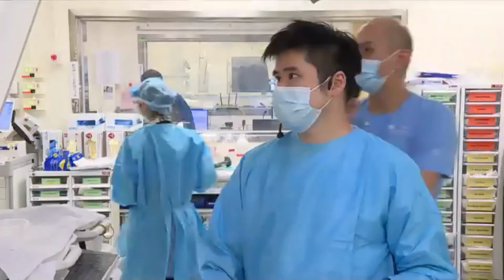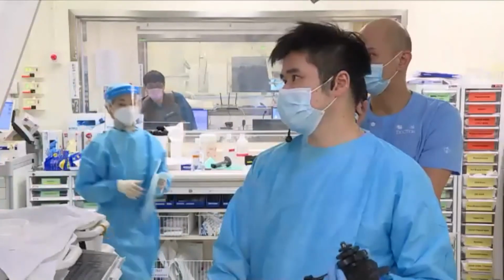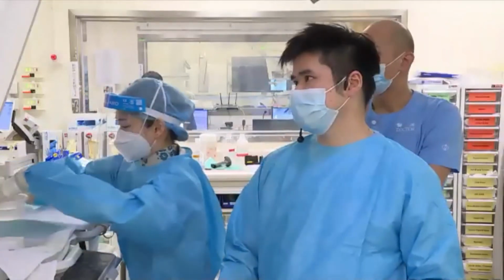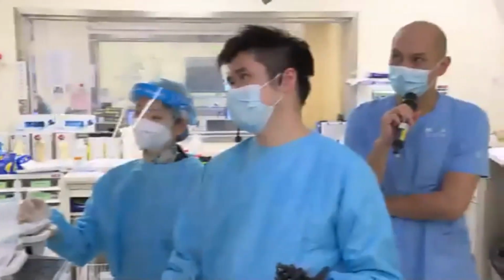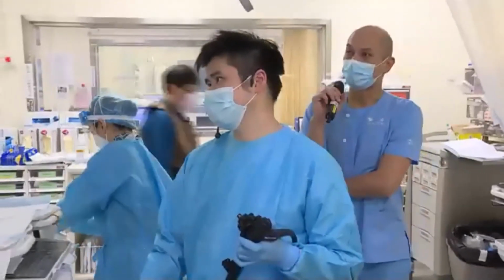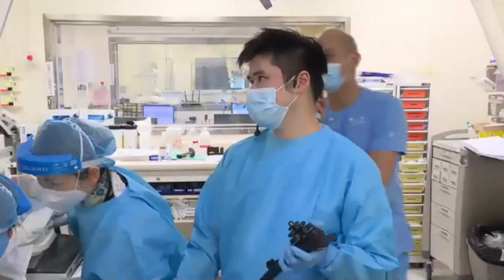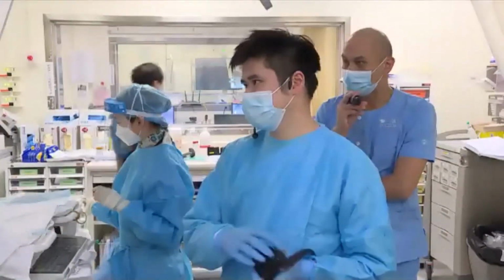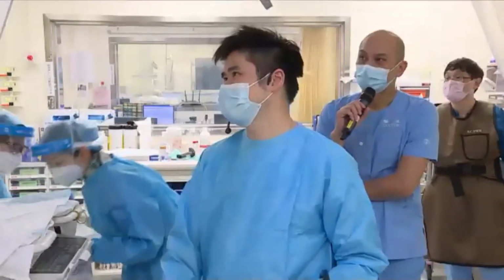So Anthony, I had a question. You guys are not using N95 or something. How is it in your endoscopy? I see all the nurses using N95, but the endoscopist is not. Actually, all our patients are tested for COVID before they are admitted to our hospital. As a standard, we suggest N95, but sometimes we can also allow the endoscopists to have some freedom. Sure. Yeah.